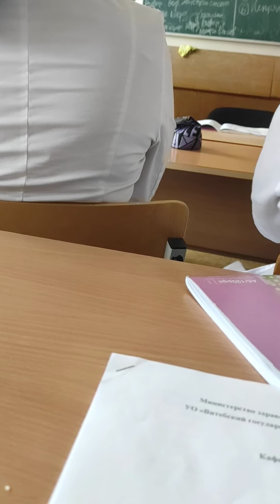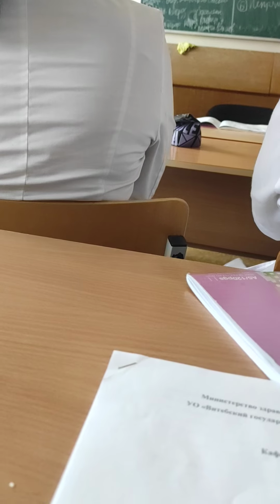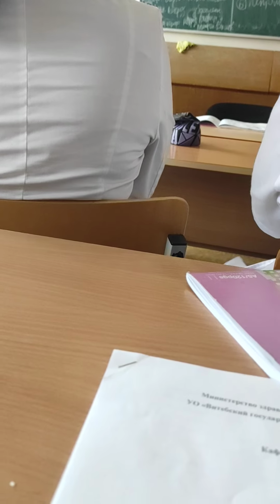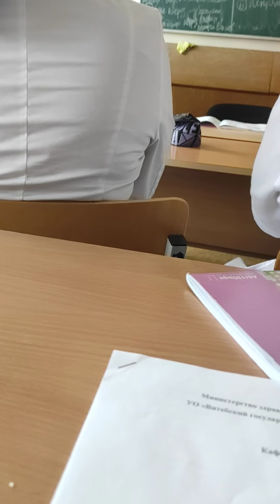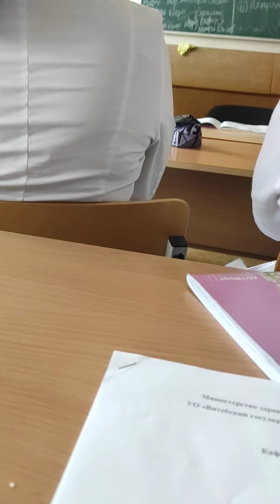During your own training, we can enlarge somebody's pupils, because when the pupils are wider, it is easier to see something on the eye fundus. When the pupils are small, the space in which we can observe the eye fundus is also small, so it is better to enlarge somebody's pupils.